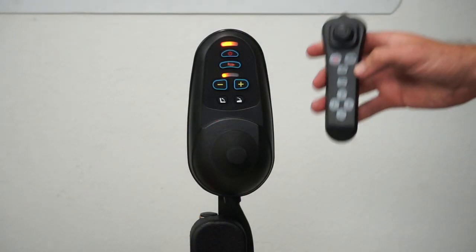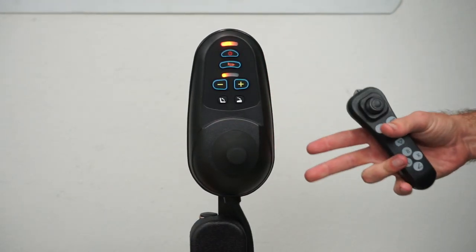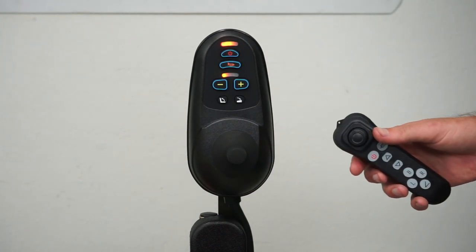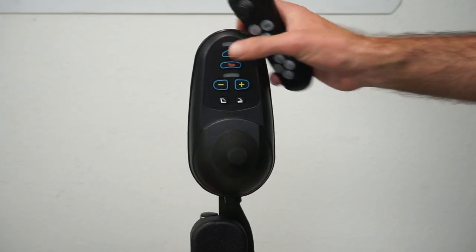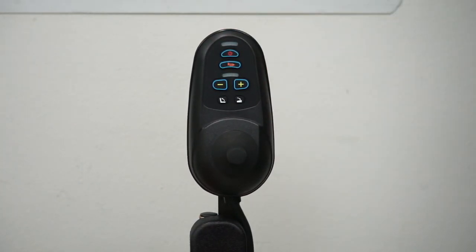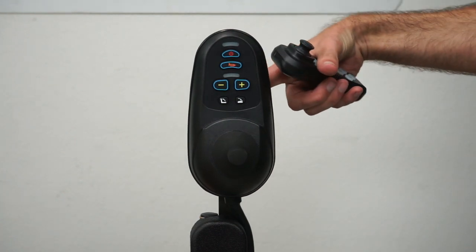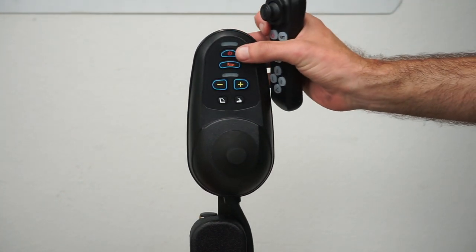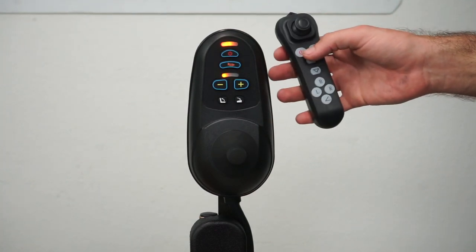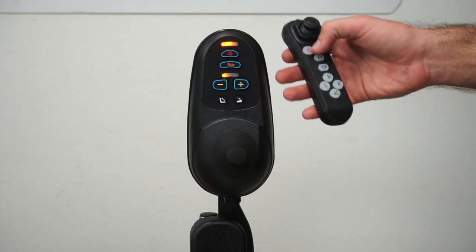Today we're going over how to pair your remote with your joystick on the Comfigo Majestic IQ7000 Auto Folding Power Chair. We're going to start by making sure everything is off. Make sure you don't have the charger plugged into the front of the joystick. Then we're going to turn the power on to the chair, and then turn the power on to the joystick or remote control.